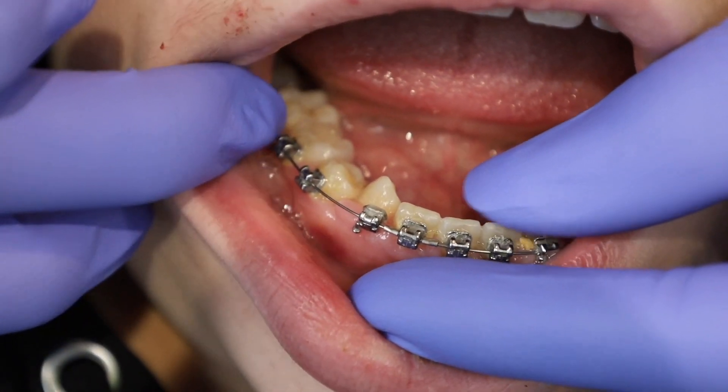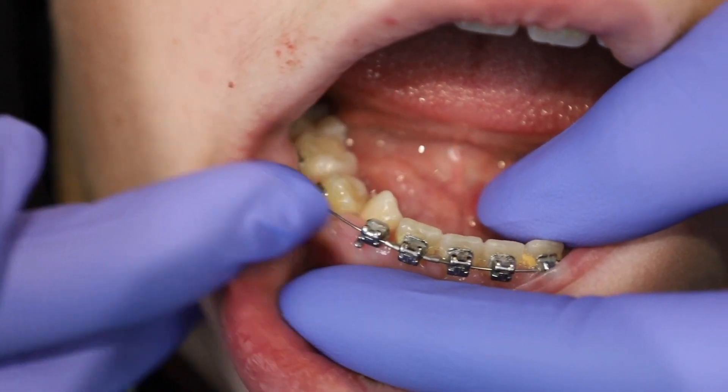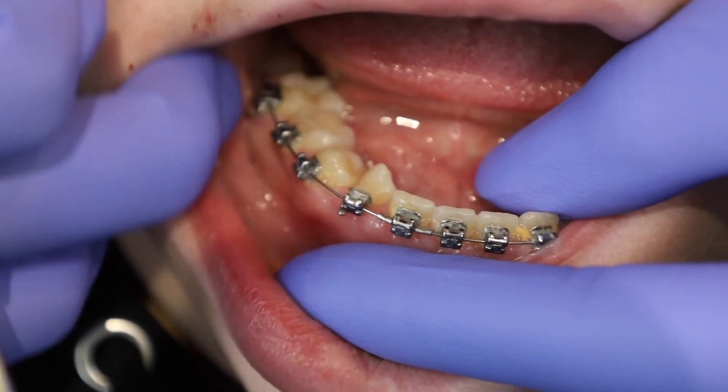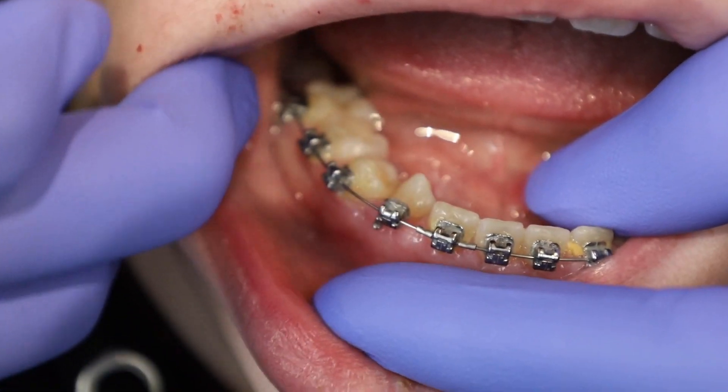If you have a broken bracket toward the front like this one, it is sometimes going to spin around the wire like this, which can be irritating. But to save you a trip to the office until you can get to see us next, here's what you can do.